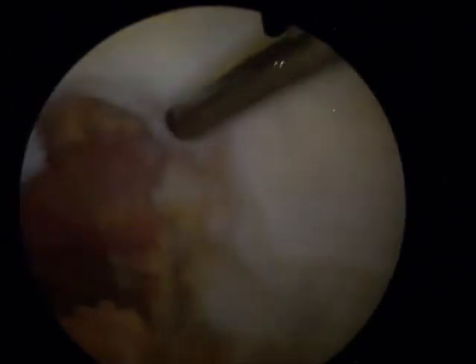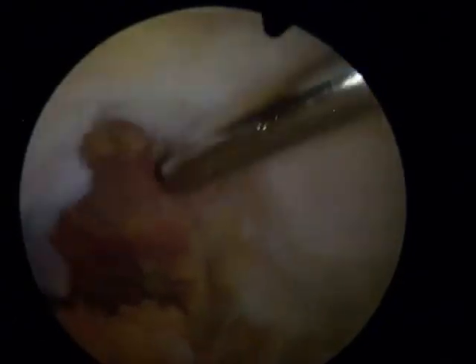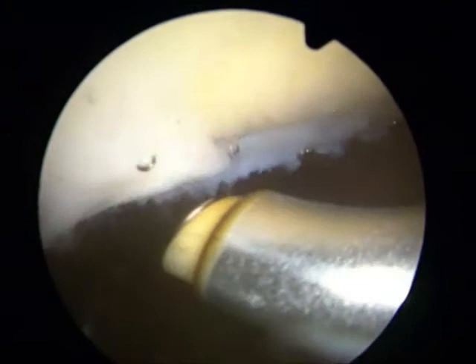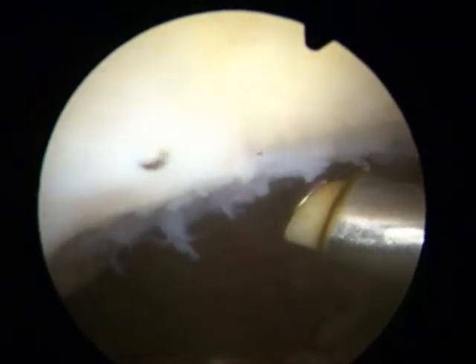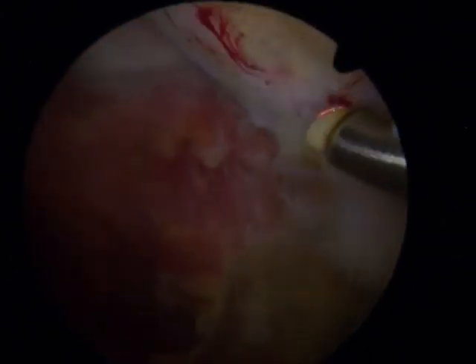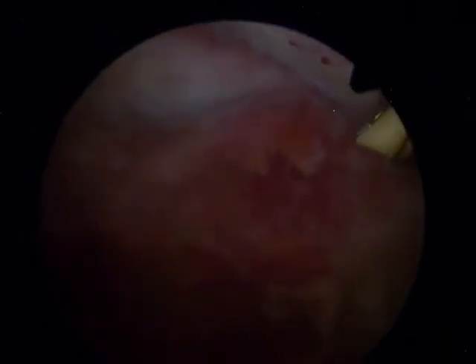Here we are now using the Smith & Nephew shaver — a great bit of kit for volume removal. You've just got to be careful you're not sucking in bits of the muscle in the suprapatellar region and anything else. And then finally, I'll use the SupraMultivac just to seal off the tissues so that you don't get any post-operative bleeding. Post-operative bleeding accounts for a lot of slow recovery after knee keyhole surgery, so if you seal off all those little bleeding vessels with the SupraMultivac, the patient recovers very quickly and you don't get these little bands of adhesion.